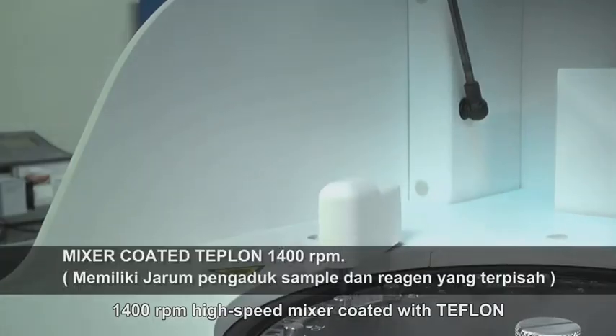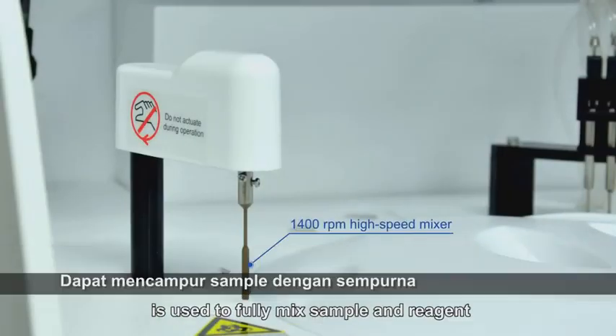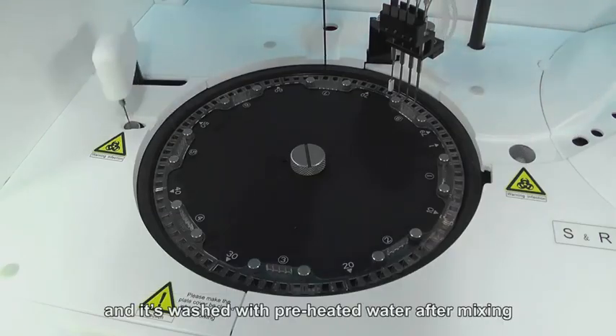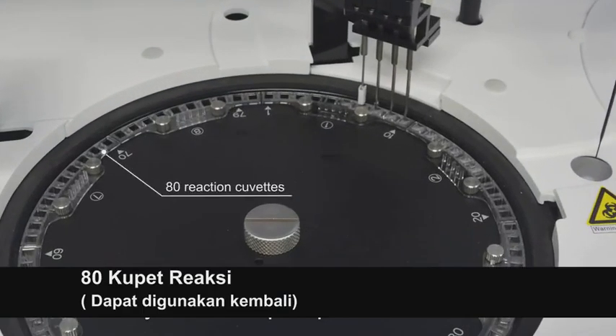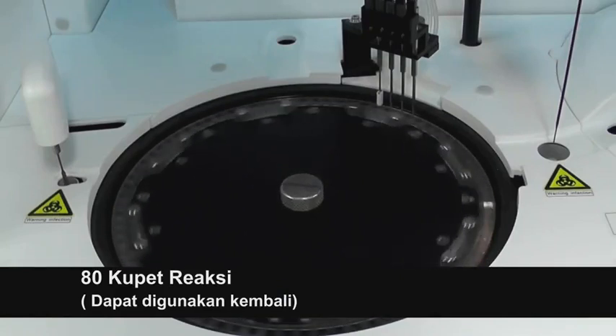A 1,400 round-per-minute high-speed mixer coated with Teflon is used to fully mix sample and reagent, and is washed with preheated water before and after mixing. A total of 80 reusable optical plastic reaction cuvettes are used for reaction and measurement.